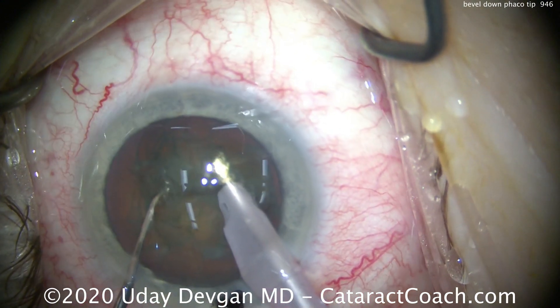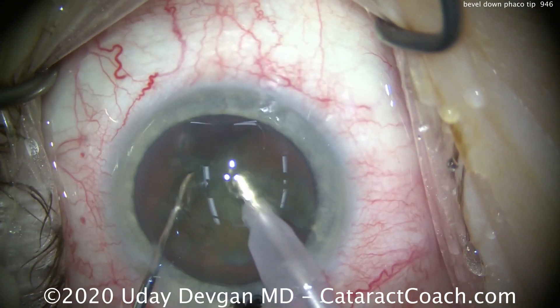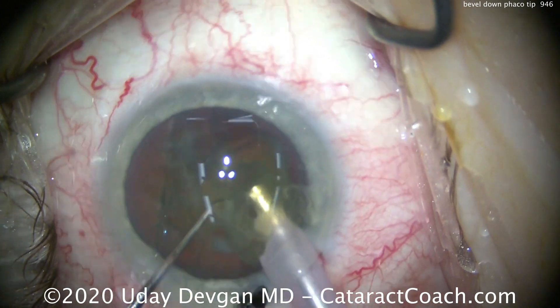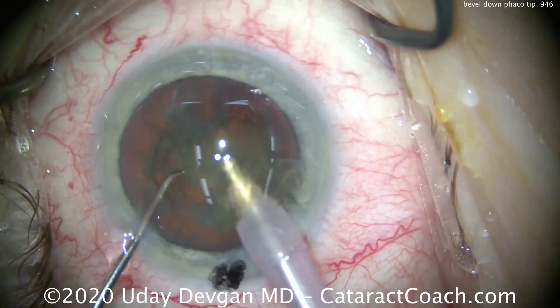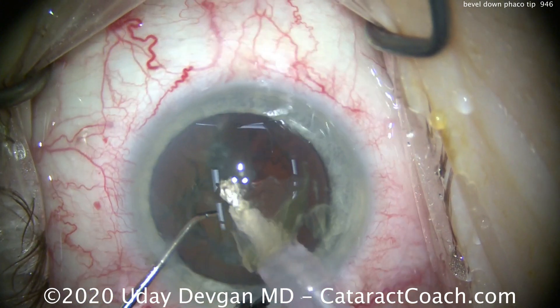Could you go bevel up? Of course you can — that works too. But think about it: if the bevel is up, it's not as easy to achieve occlusion. You have to put the probe deeper into the nucleus just to get occlusion.